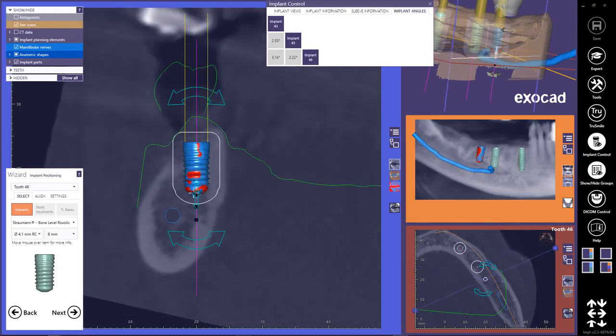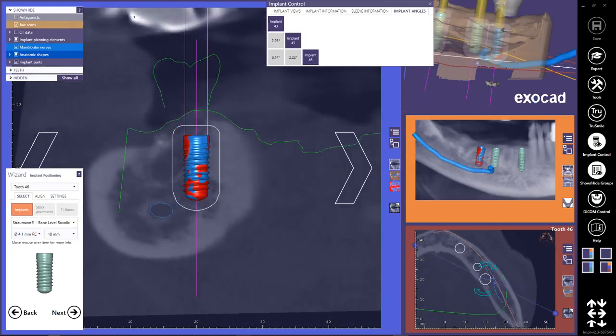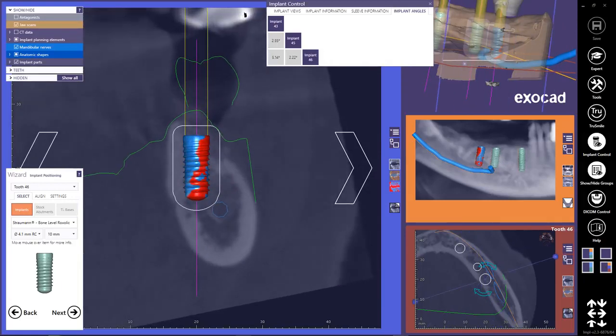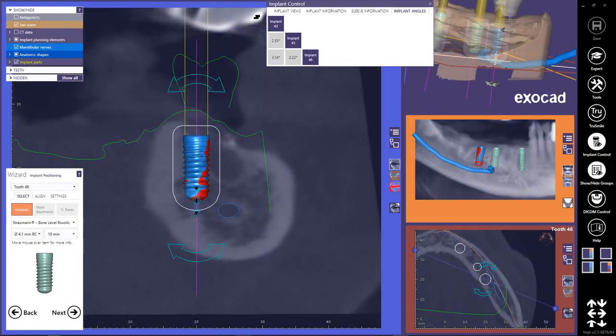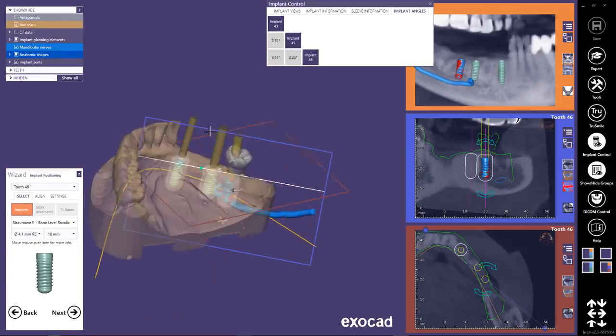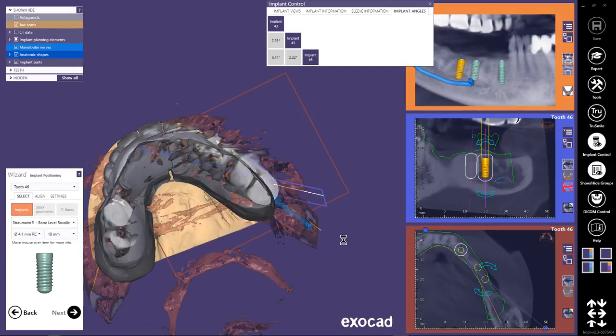Let's see if I can have a longer implant. Nah. Oh yeah. Could use this one. Safe for the canal. All right. And our angles are within a reasonable limit. We can blend in all those. Looks okay for a bridge placement. Let's go further.